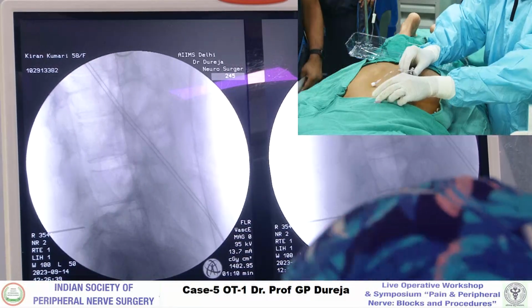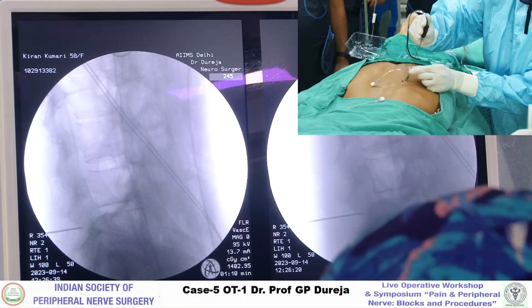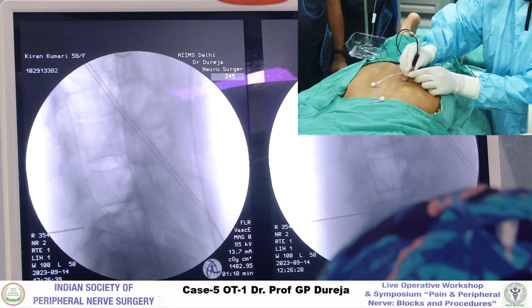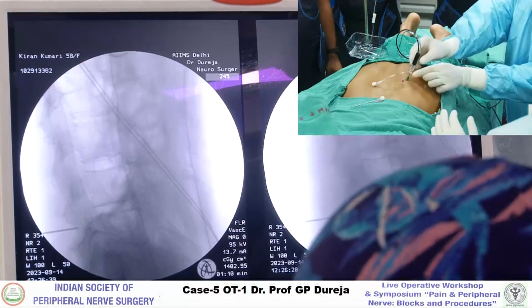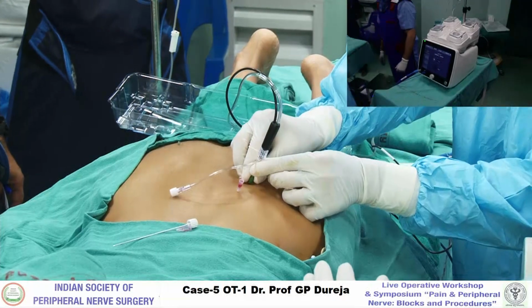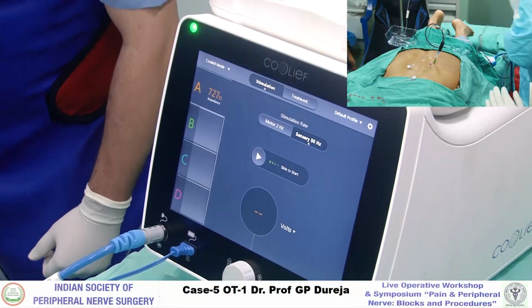So we cannot deeply sedate the patient because patient cooperation is important while doing the stimulation. So we tell her that we will be doing the stimulation, and there should be a local sensation. So impedance, can you check? Somebody can show the machine, please. What are the parameters? So you check the impedance. 715. Yeah. Coming down. That's okay.